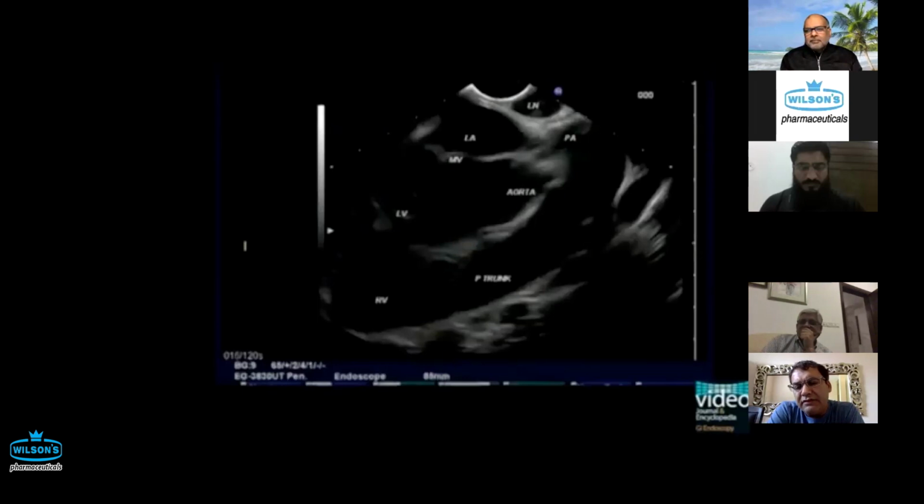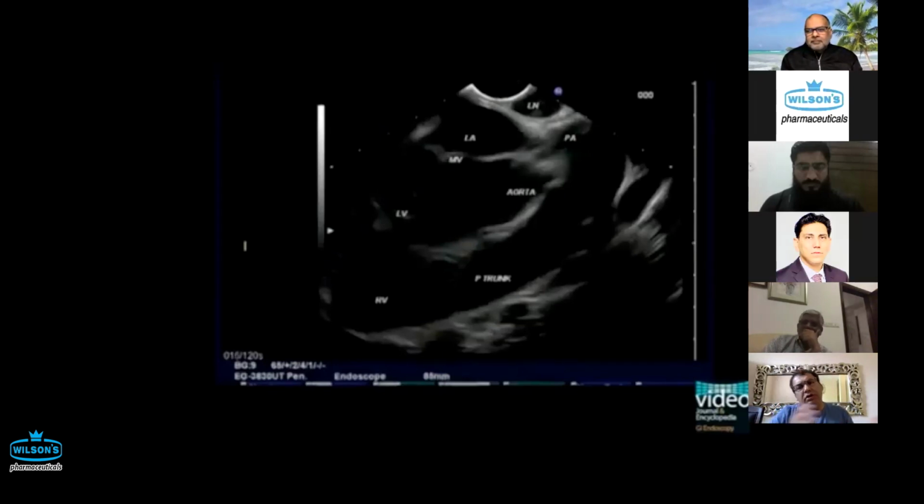When a patient is lying on the left lateral and the esophagus is in the posterior mediastinum, you put the scope in. What I call the neutral position is when the scope's head rests on your palm, views facing up. In that position, the transducer looks anteriorly towards everything in the mediastinum.